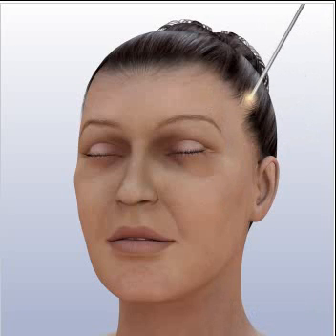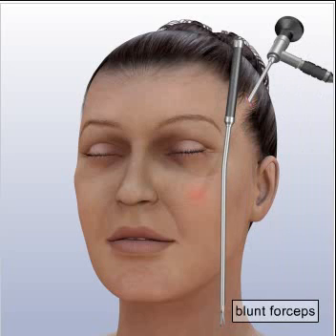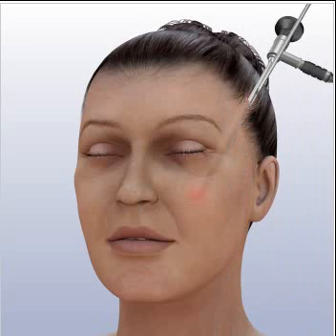It is a thin, tube-like instrument used to see inside the body. In order to access the fat deposits that will be lifted during the procedure, the physician may use blunt forceps to elevate the underlying tissues. Working toward the mouth, they carefully lift the tissue, creating a small tunnel in the midface.